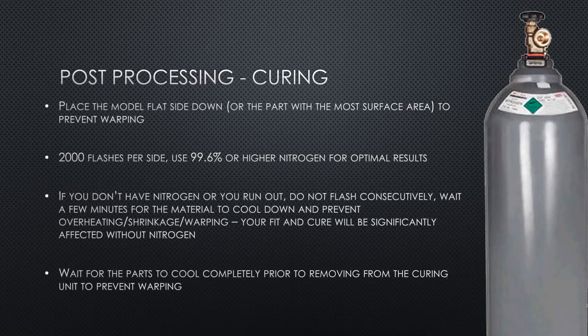Wait a few minutes for the material to cool down and prevent overheating or shrinking or warping. The fit and finish of your prints will be significantly affected without an oxygen inert environment. So try to keep as much nitrogen or glycerol on hand as you can. And then finally, of course, you want to wait for your parts to cool completely prior to removing them from the curing unit to prevent thermal shock and warping.